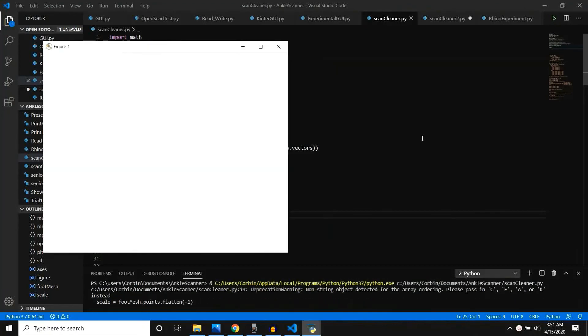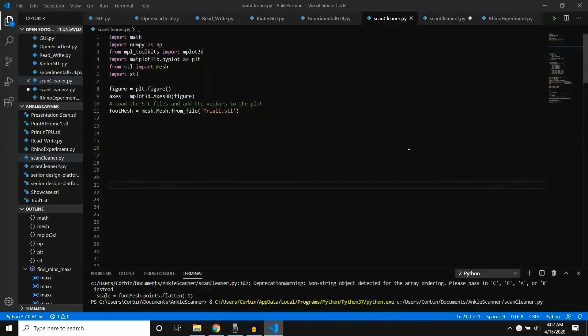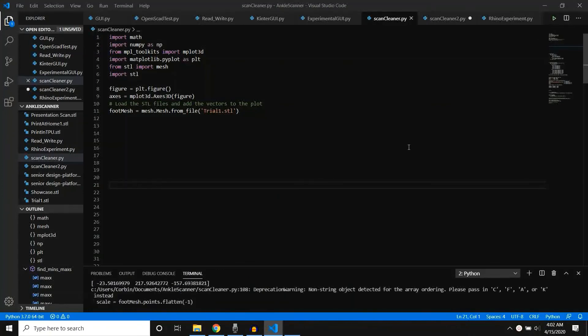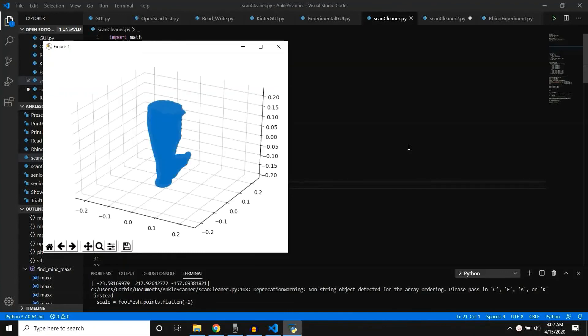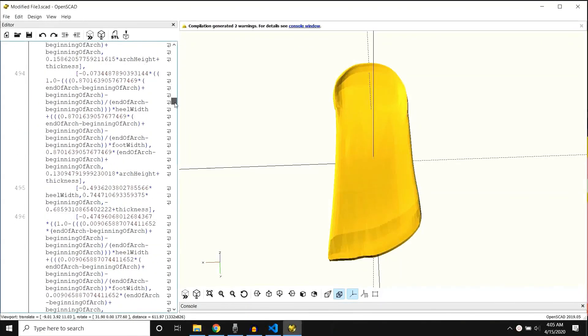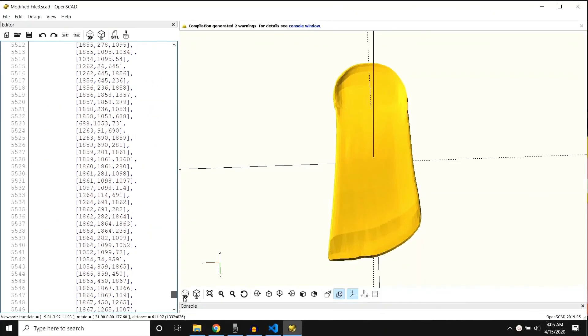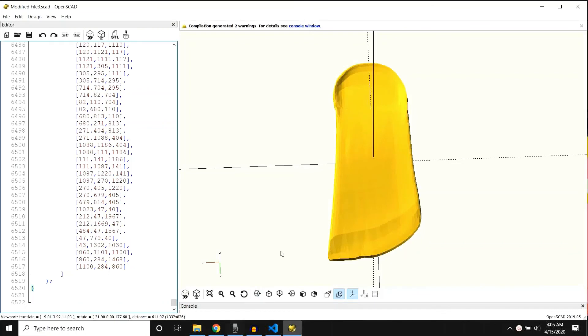There are a few problems when the file is exported as an STL file from MeshMixer — the STL file is not properly centered, scaled, or rotated. Through Python, we were able to fix the STL file so it could be imported into the CAD software used for custom orthotic creation. The CAD software we use to generate orthotics is called OpenSCAD, a free, open-source, programming-based CAD language. To avoid working directly with the code, a person using this system would use the GUI we developed in Python, which interfaces directly with OpenSCAD and enables the user to manipulate the orthotic through an easy-to-use interface.